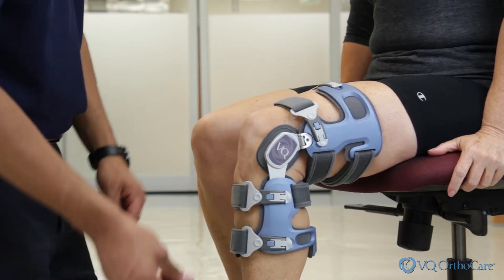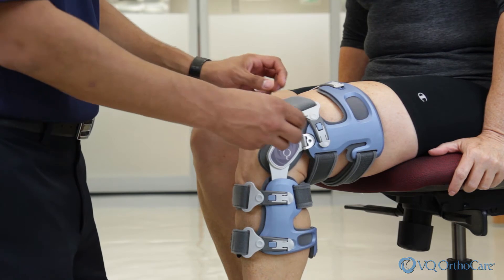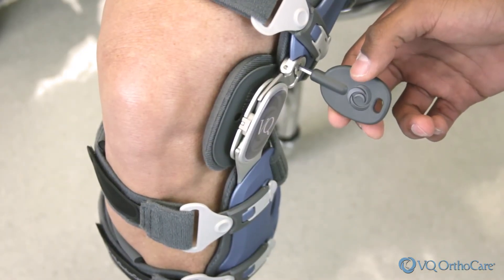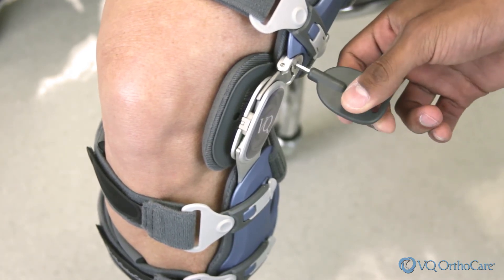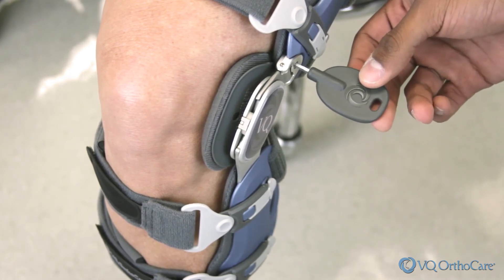With the patient seated, bend the knee to 90 degrees. Next, using the patient adjustment tool provided, turn the Q-Hinge screw a quarter turn clockwise to increase lateral compartment relief, or one quarter turn counterclockwise to increase medial compartment relief. This is a good starting point for initial use.